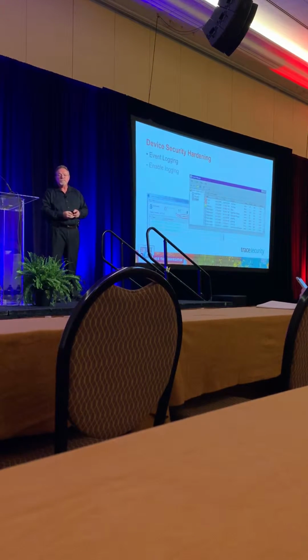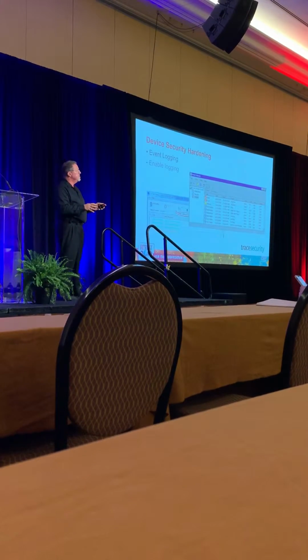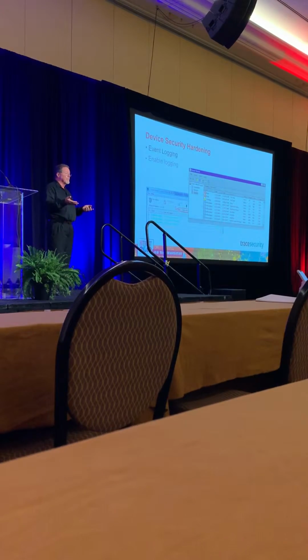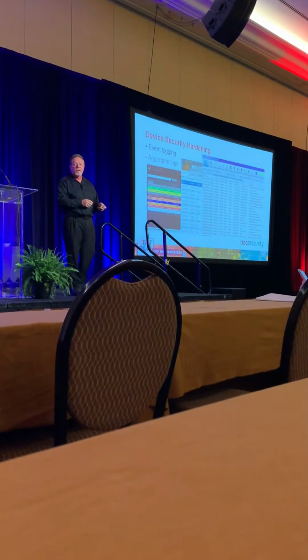And then finally, this may not seem like a preventative measure, but part of the hardening checklist is typically making sure event logging is enabled on devices. Not only will event logging provide you with a record of what happened on the device, should you ever need to go back and do post-investigation or forensics, but it can also be used in a more proactive manner.